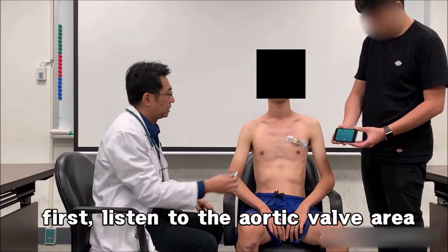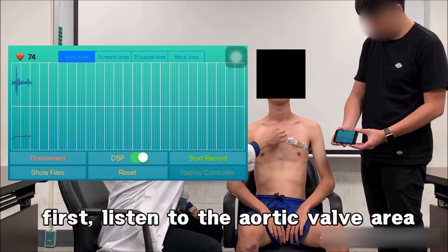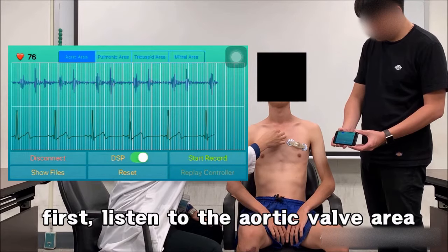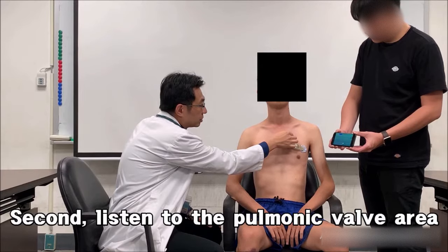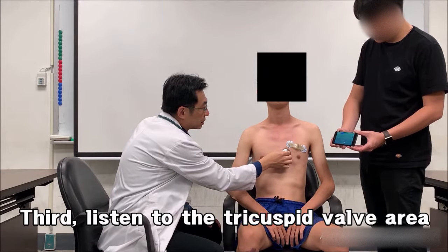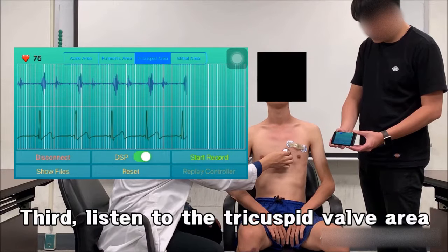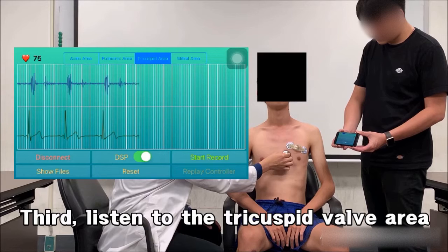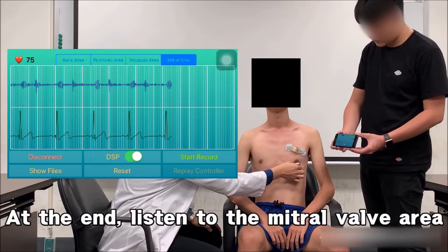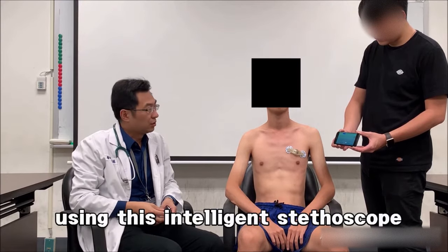Same as the traditional one. First, listen to the aortic valve area. Second, listen to the pulmonic valve area. Third, listen to the tricuspid valve area. And the above is a complete flow of using this intelligent stethoscope.